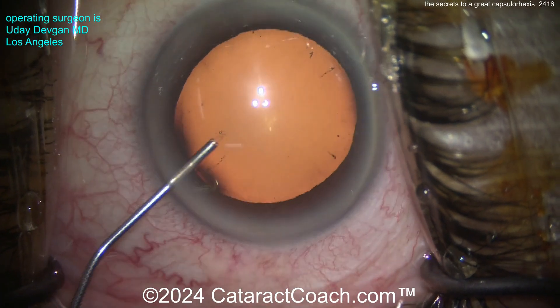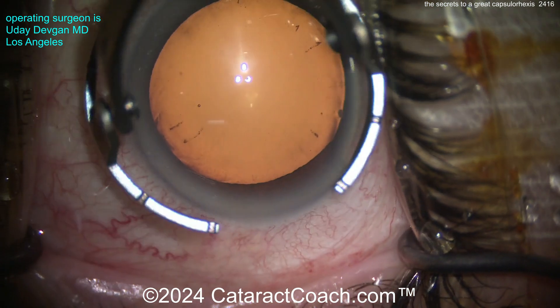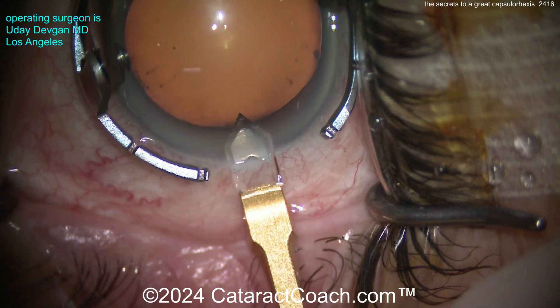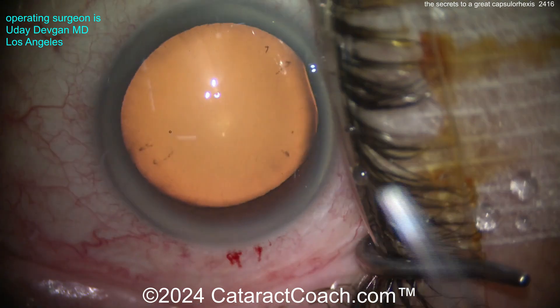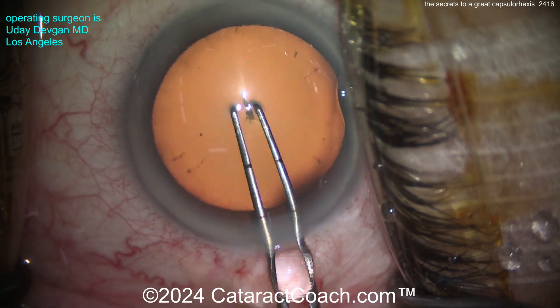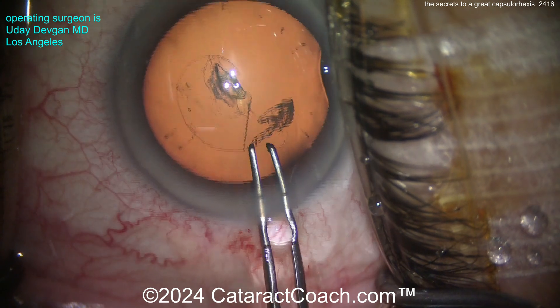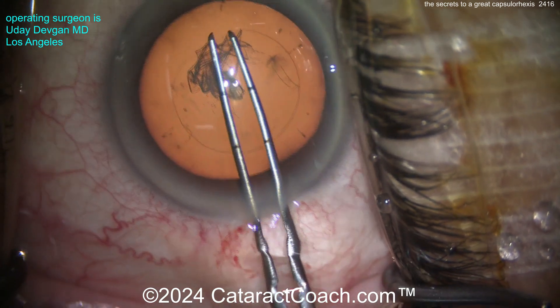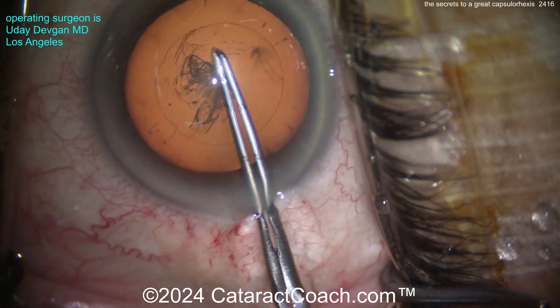Let's go back to the routine case one more time. Viscoelastic going inside — you want to flatten the anterior lens capsule. IOP at about 20 mmHg. Here comes the diamond keratome making our incision — it's a two millimeter keratome, so I'll slightly enlarge it once I enter the eye. Now with the forceps: first things first, get an idea — these are marked forceps, two-and-a-half and five millimeters, those two marks. I start the rhexis, and I was able to poke in very easily, so there's good zonular support — nice taut anterior lens capsule. Pivot, pivot, pivot technique — keep it nice and round. Beautiful rhexis, exactly the way we like it.